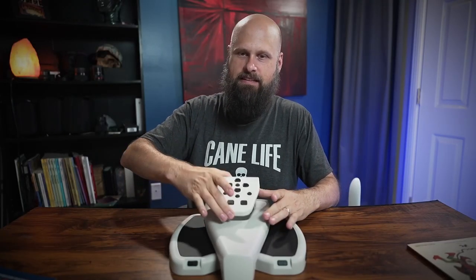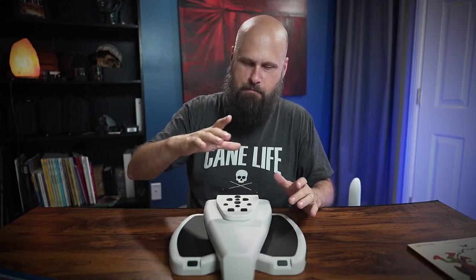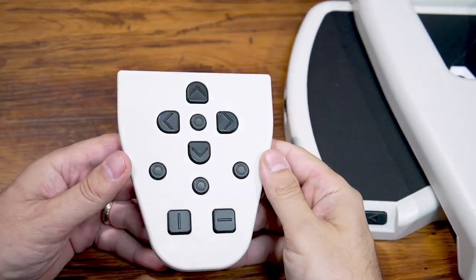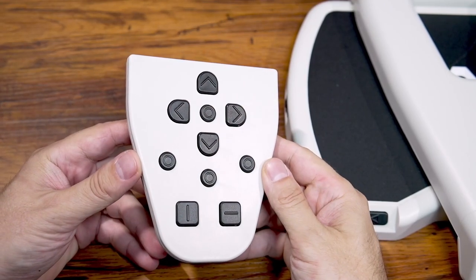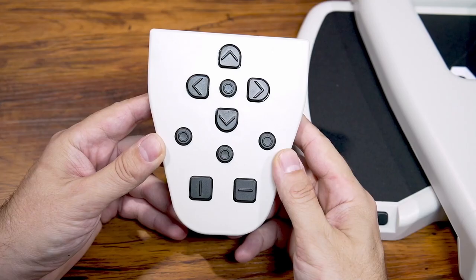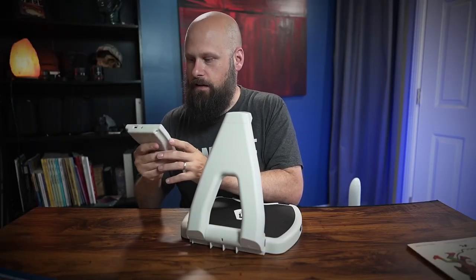On top of the arm there's a keypad that is removable — it attaches via magnets, and they're strong enough that it doesn't fall off when the arm is up. This keypad gives more control over reading playback. It allows you to skip by word, by sentence, by character, and you can also save your documents through the keypad. So a lot more functionality with the keypad.